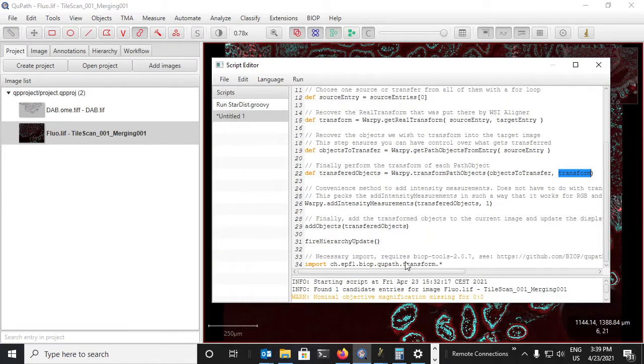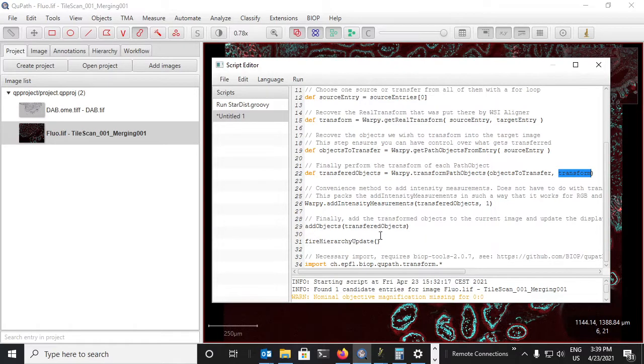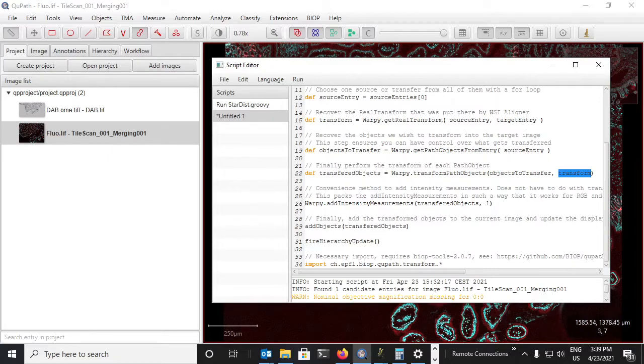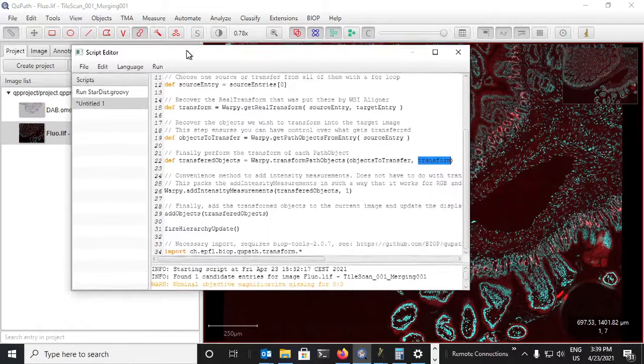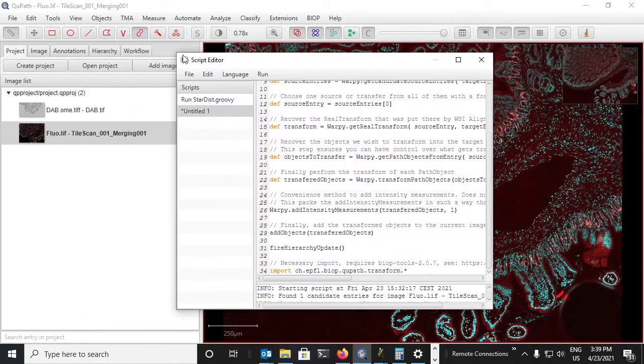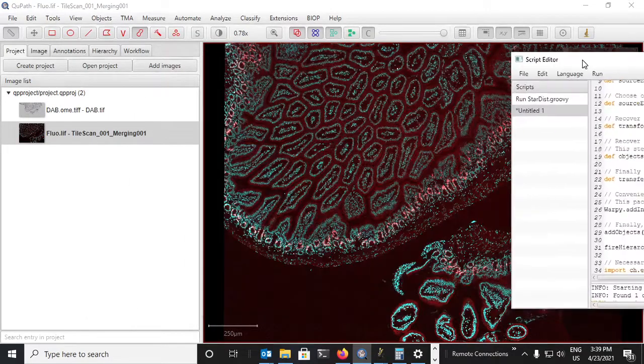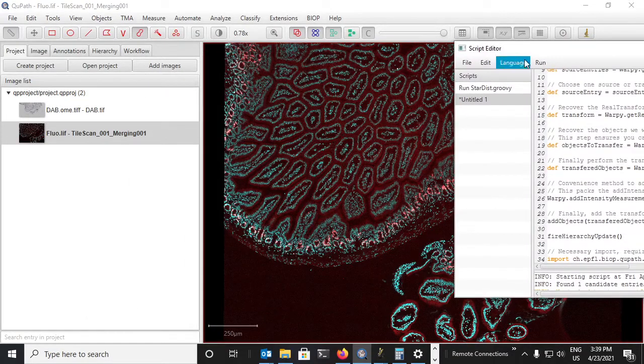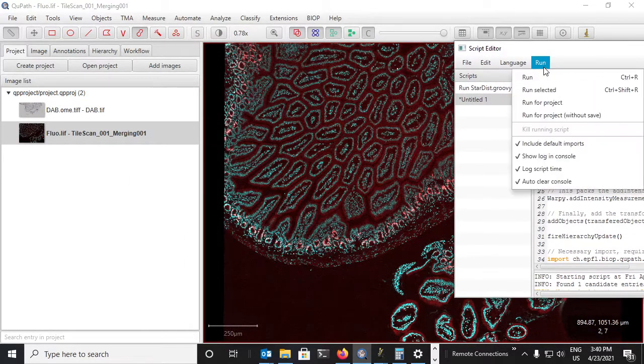Then the rest is more housekeeping. We add the objects to the scene and we make sure to update the GUI. And what that looks like from here - so you'll notice that my fluorescent image has no detections. And if I run it, you'll see now that it's transferred the DAB image onto the fluorescent image.